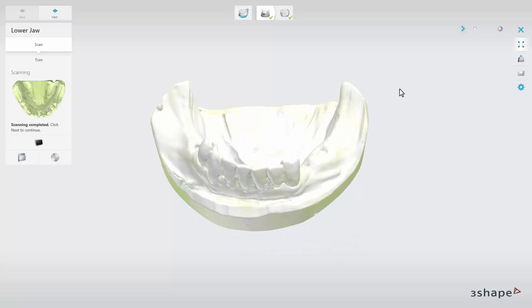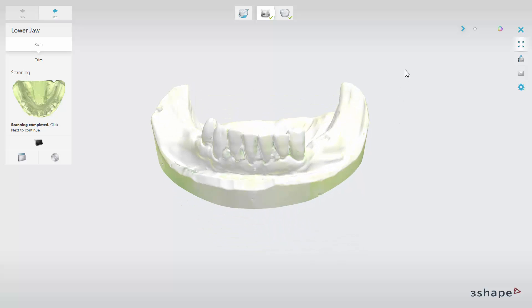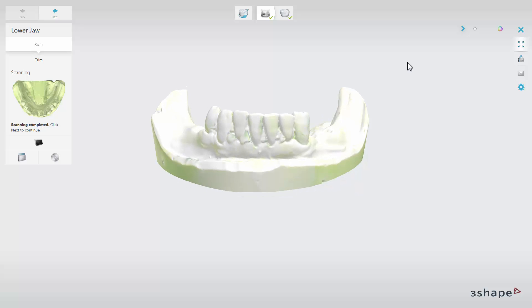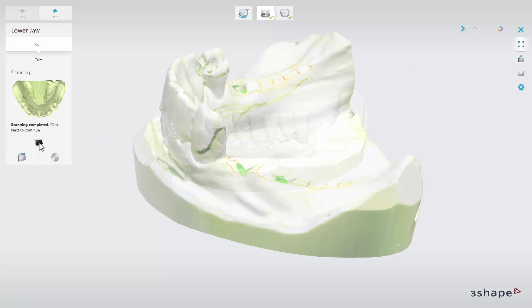That's why we will take the model out and do the surveying analysis. There is no need to create a new order. Simply finish the analysis on the model, insert it into the scanner, and click the Rescan button to continue.